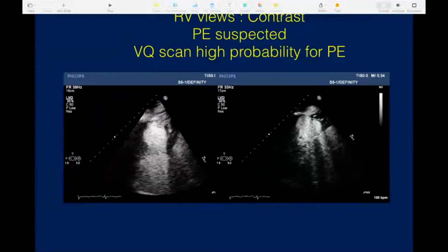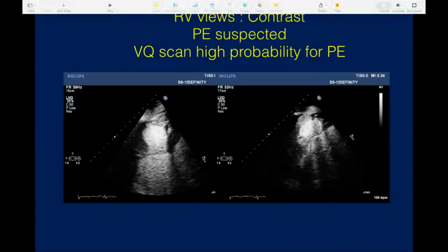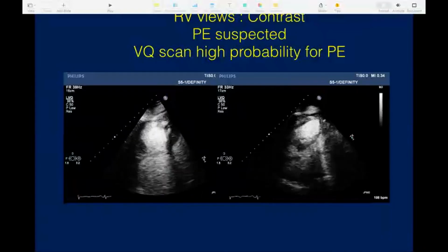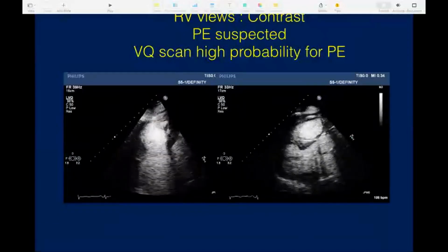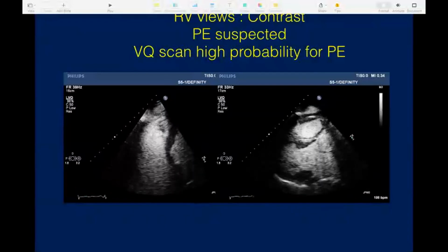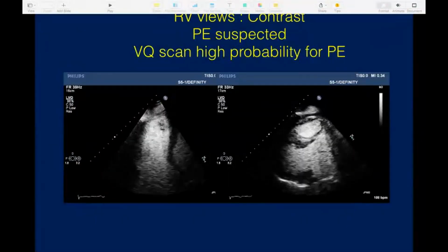And the second question is, given that complications from contrast use are negligible, why don't we use contrast in every echo study, regardless of endocardial border visualization? For example, the example that you showed of apical HOCM, the diagnosis in many patients can be missed. Well, in the ideal world, yes, but remember that with every dose of contrast comes cost. Typically that varies anywhere between $95 to $120 per vial. So obviously that would be a huge additional burden.